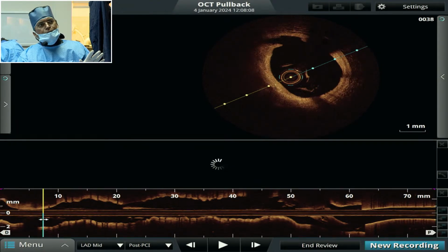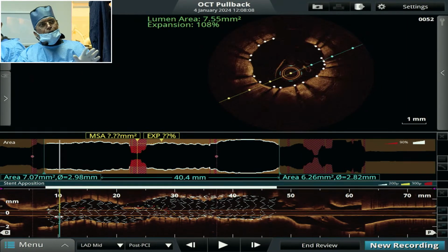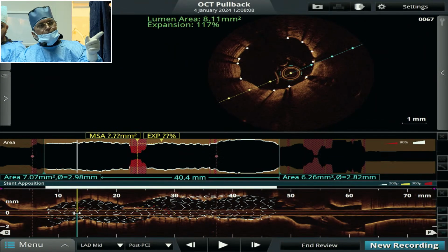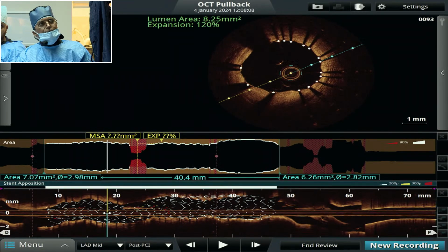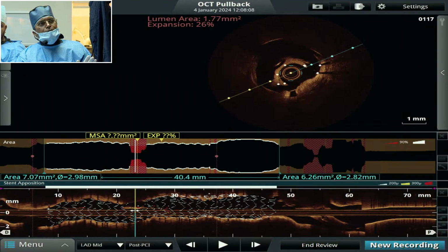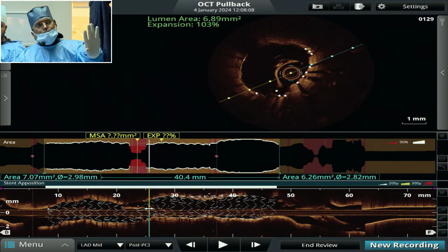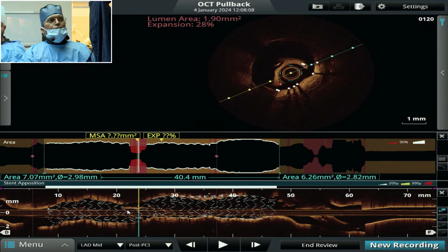So, yeah, area 7.59. One area showing some red marker. Let us see what it is there. You can see this 8.69. Come. This area, come. There is an artifact because of that it is showing 1.7, but the actual area is good. So no need to mark there. Keep it there. Take the diameter. Take the diameter there.